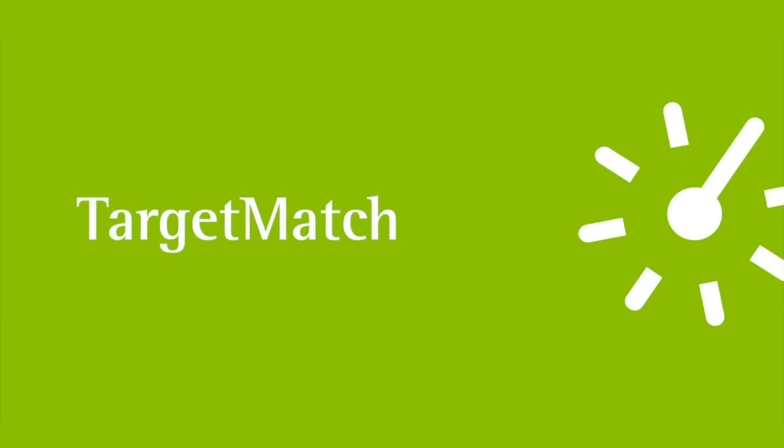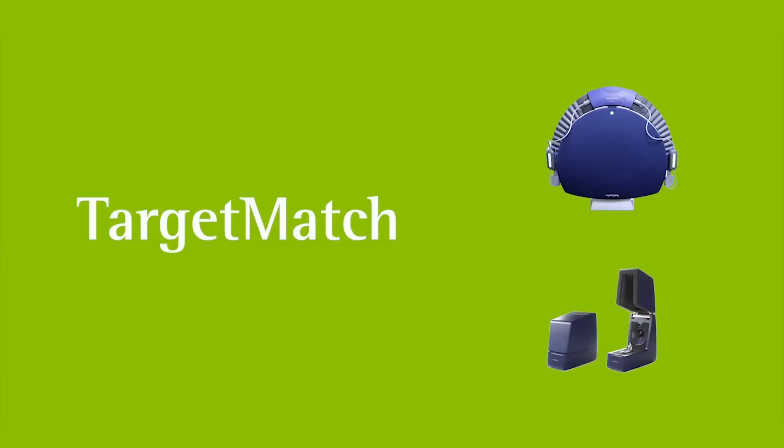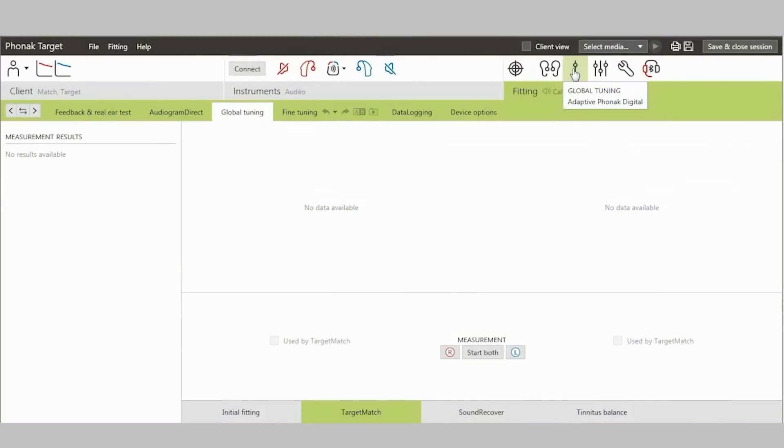In this video, we will show you how Target Match works in Phonak target fitting software. Target Match is a fully integrated system that provides a seamless guided workflow for performing real ear measurements or test box verification to address a wide range of client needs.